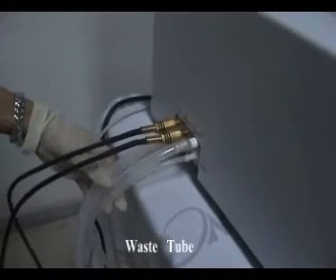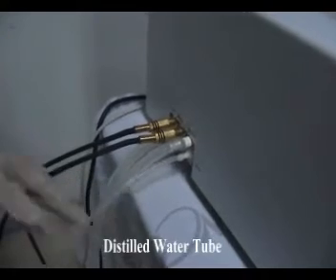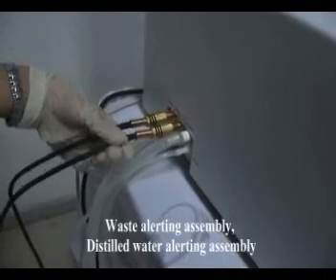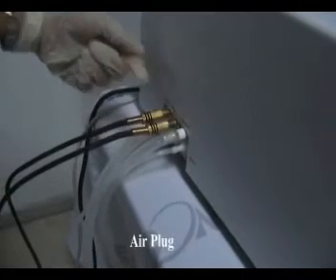Waste tube, distilled water tube, waste alerting assembly, distilled water alerting assembly, Air plug.